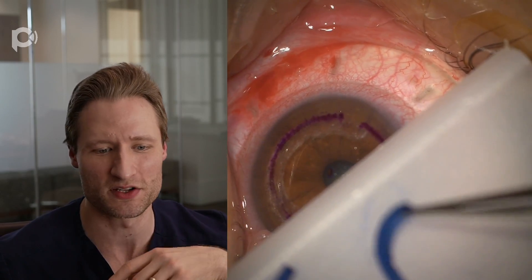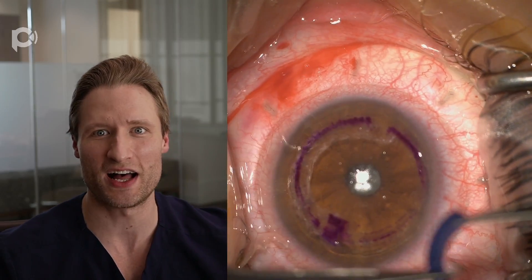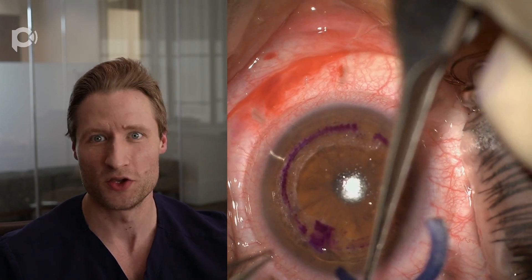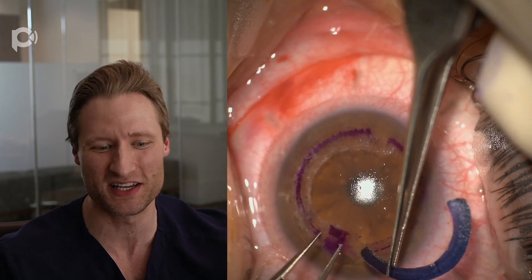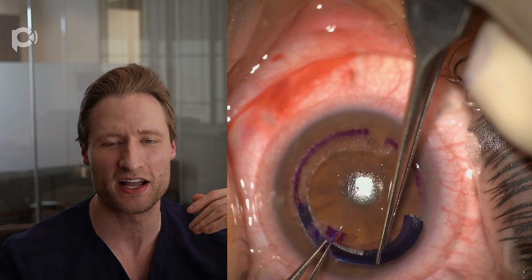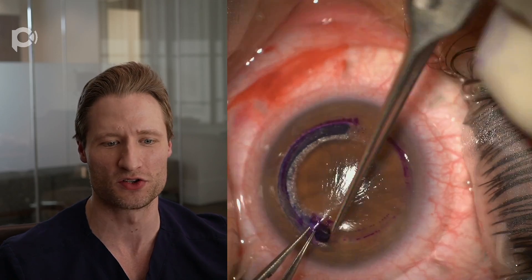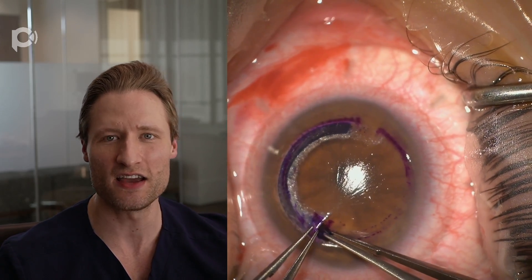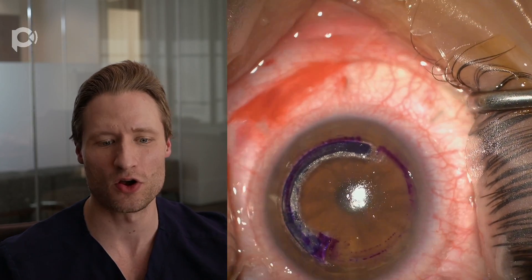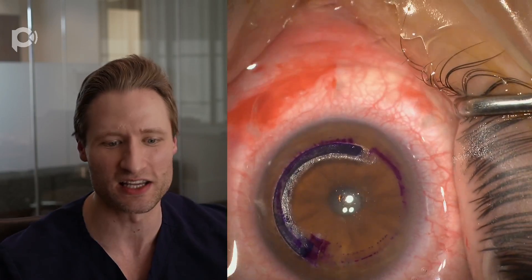Here are the CARES segments — there are two of them. They come already stained and dried from the Advancing Sight Network, the eye bank that we use in Alabama. You can call them and request these corneal segments. Look how ridiculously easy these are to insert — you feed them into the eye, they're perfectly flattened, stained brilliantly blue, and they feed into this corneal channel just as easy, if not easier, than an Intax segment. You push them in and that's the whole surgery. The surgery is now completed. Isn't that shockingly, ridiculously easy?